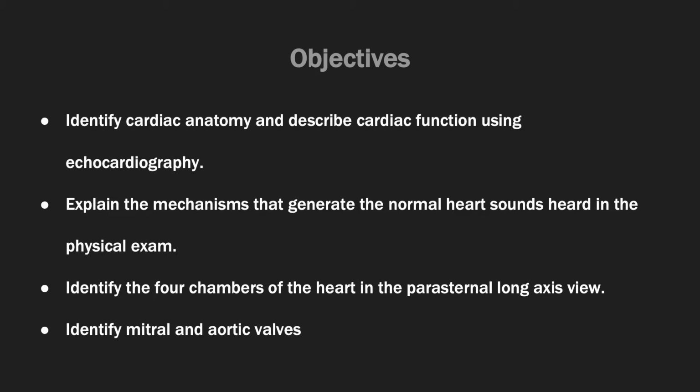This is meant to be an introductory video. Don't think that you need to know everything that is mentioned in detail. Ultrasound is a complicated imaging modality that can sometimes be unintuitive to new medical students. And at the end of this module, we hope that you'll have a very basic understanding of how ultrasound can be used to look at the heart.